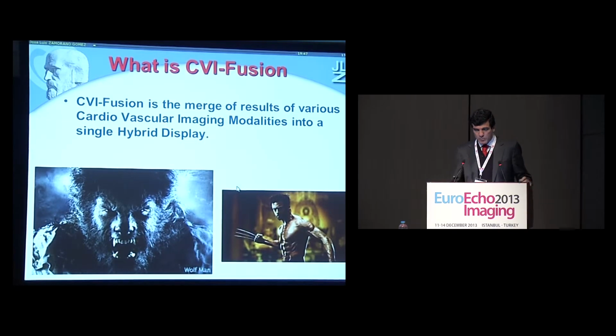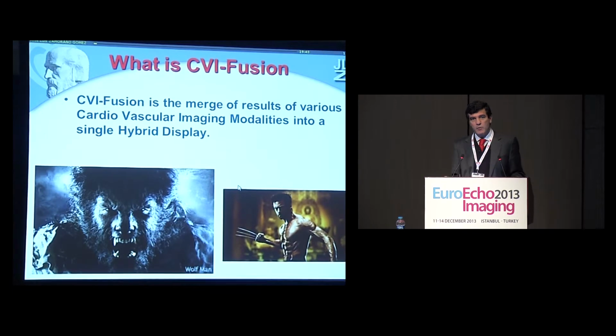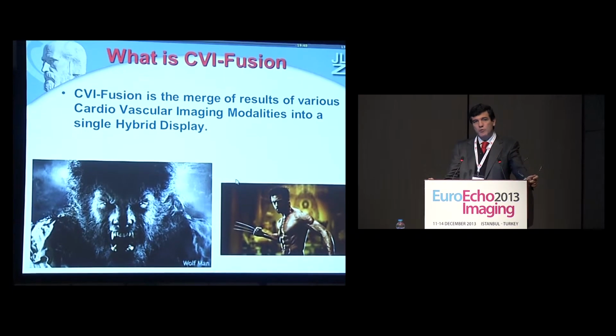And there is no doubt that we have seen excellent information related to echocardiography. Echo, 3D echo, allows you to really analyze what is happening inside the heart and how is the systole and diastole in a much better, comprehensive and accurate way.